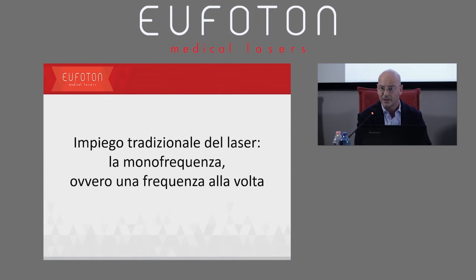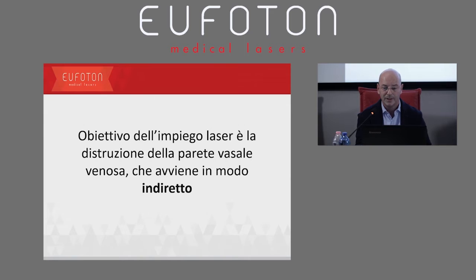I use monofrequency, that is to say one frequency at a time. In my case, in a hospital where I worked, I've used this for 6 years, 808. Actually, I decided to change to dual boost, because having two frequencies create a radical change in terms of results.